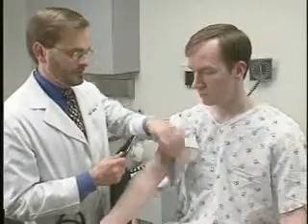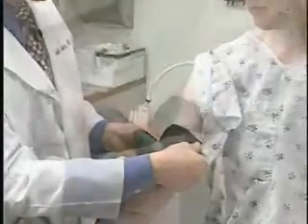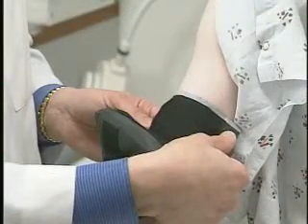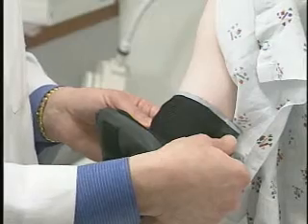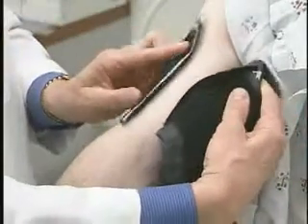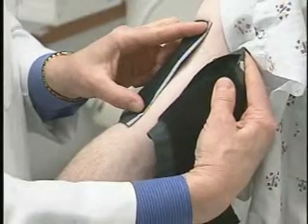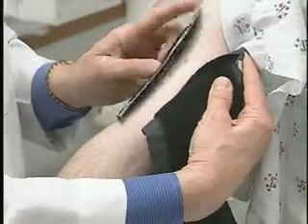To determine which cuff is appropriate, we need to measure 2 different variables on the arm. We measure the width of the blood pressure cuff against the patient's arm. The width of the blood pressure cuff should be approximately 40% of the circumference of the arm. Also, determine the total length of the bladder of the blood pressure cuff, which is where the tubes come out of the blood pressure cuff. When you wrap the blood pressure cuff around the patient's arm, the bladder should approximately be at least 80% of the circumference of the arm.